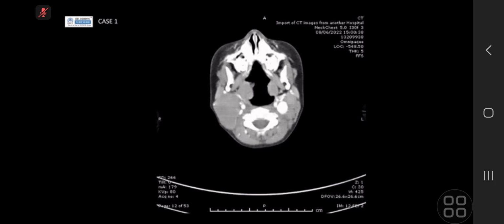Okay, so if I give you a bit more information, this is a girl. She is 7 years old. A bit of weight loss, appetite loss, but nothing specific. Does this change? Yes, I will go with the lymphadenopathy more. I will go with lymphoma. It would be lymphadenopathy from lymphoma, as a result of weight loss at this age. And would you do any further imaging to confirm what this is? Because you gave me quite a few earlier.